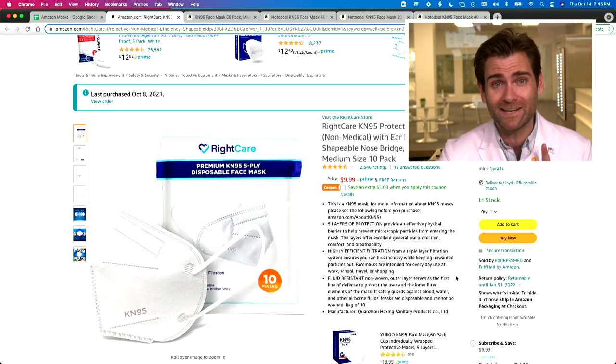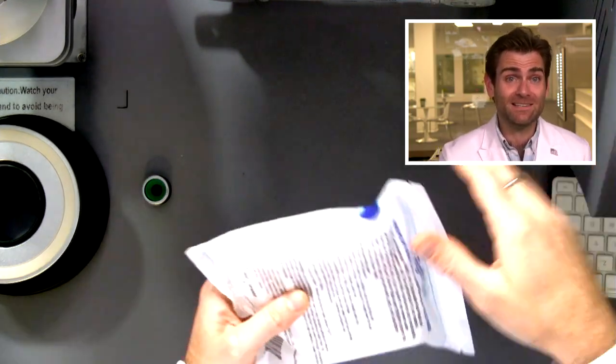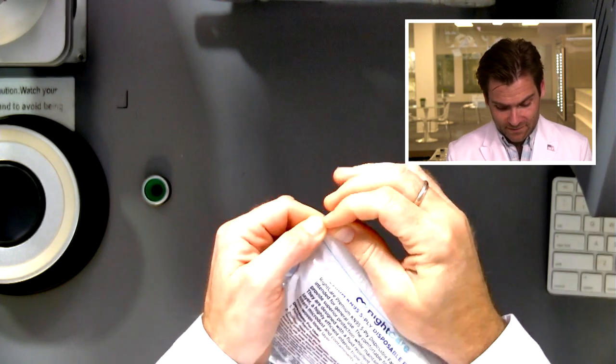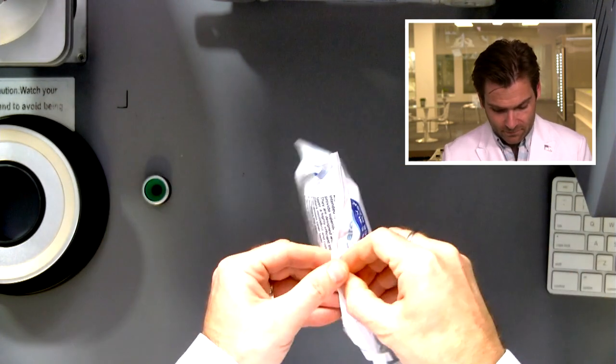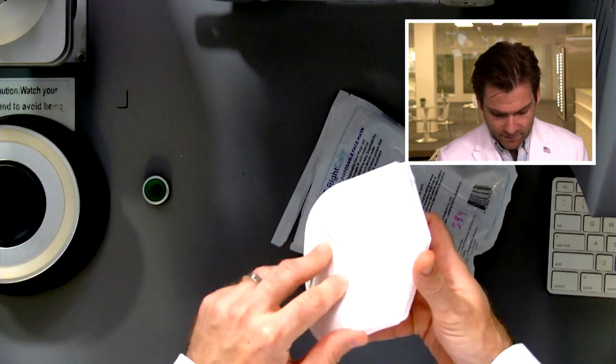Hey everyone, welcome back. We're testing every single mask on Amazon. Today we're looking at Right Care. Let's get it in the clamper and see what tests.